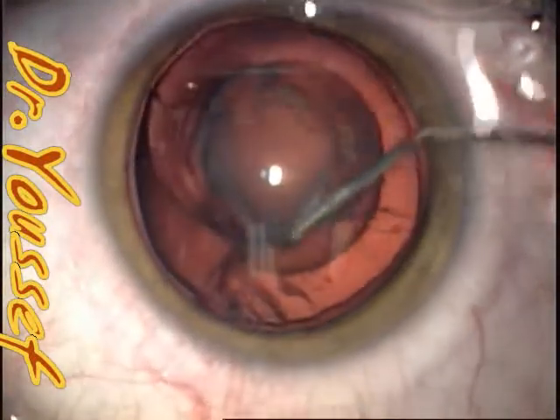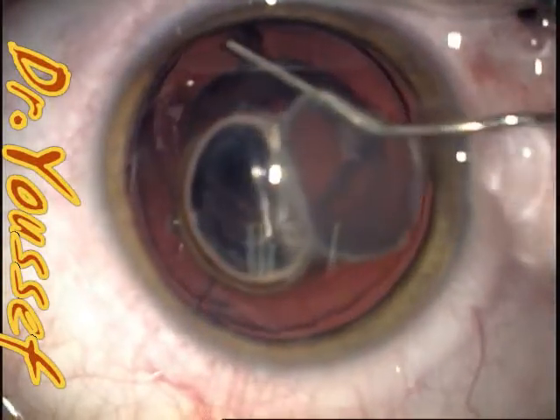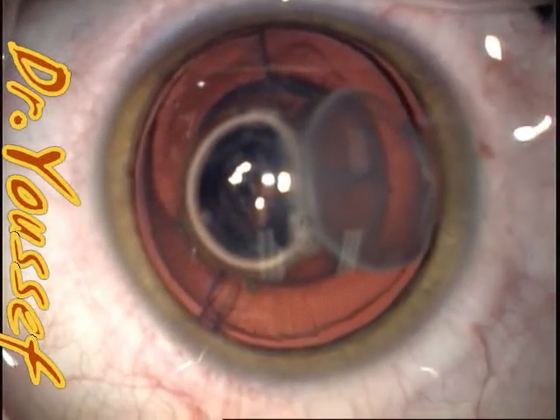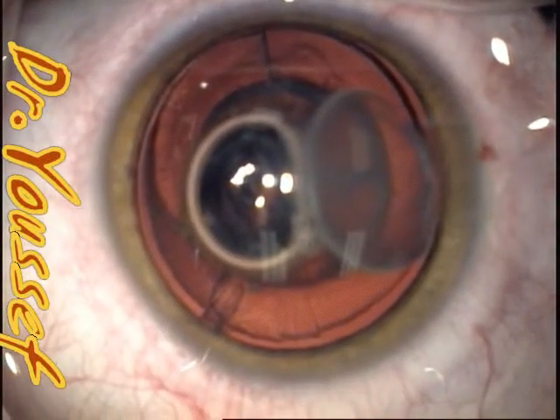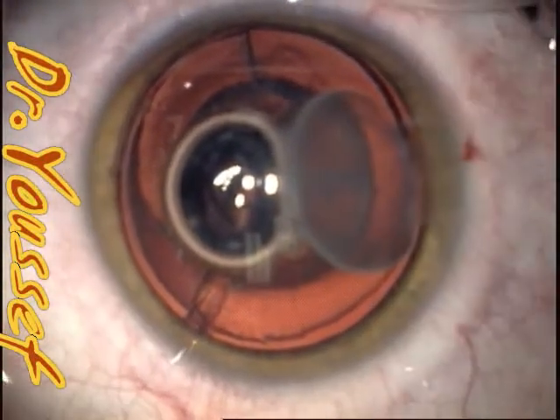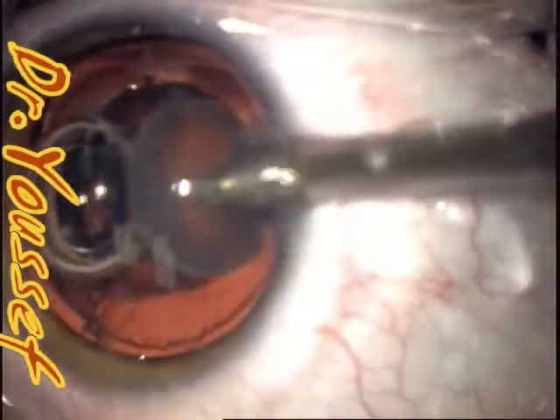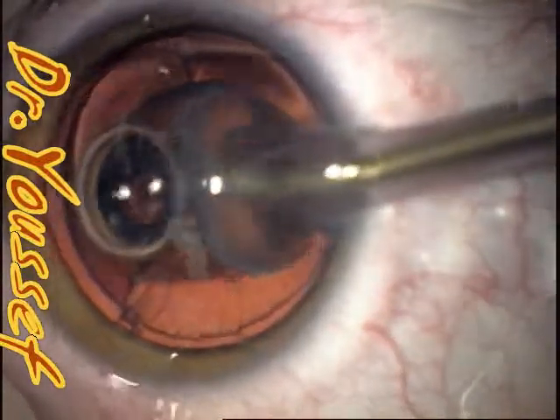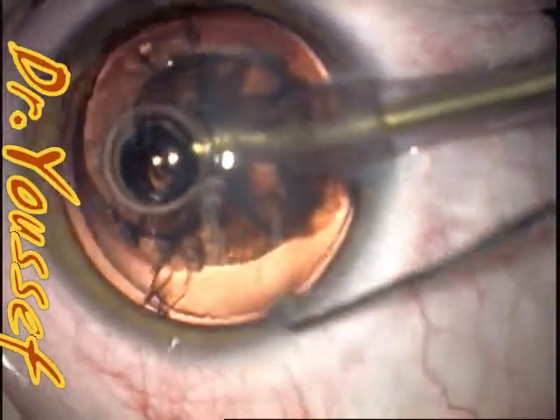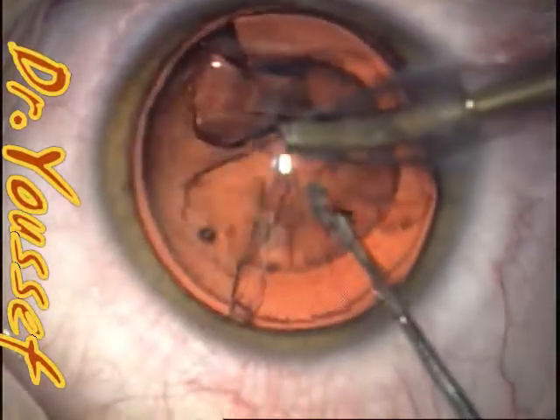Hydrodissection with minimal hydrodelineation. You'll find here that the lamellar cataract actually went completely out of the capsule, almost outside the lens, including the nucleus. So it's mainly irrigation aspiration rather than phaco, but we'll use the phaco probe as usual to manipulate the materials and remove them. There's no hardness to this cataract at all — it's a completely soft cataract.